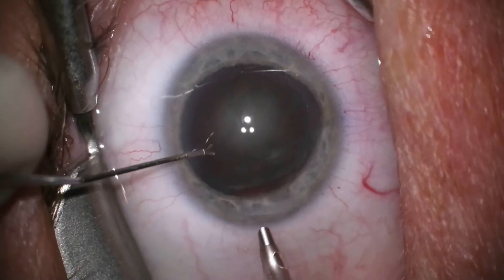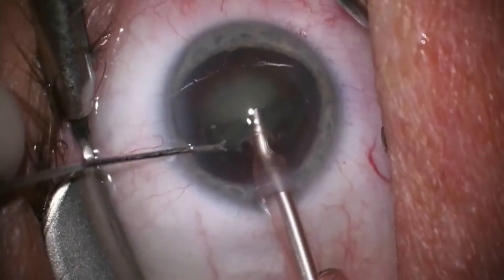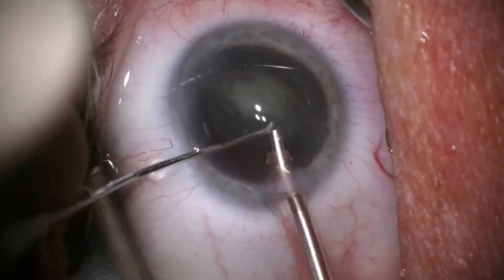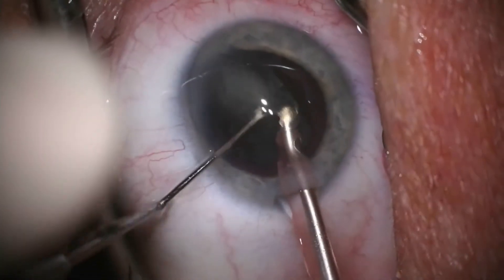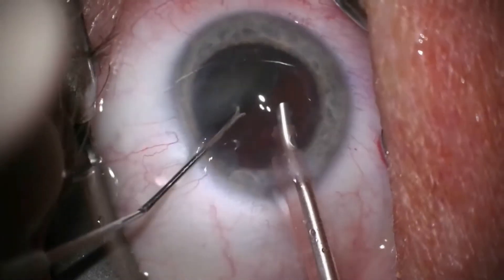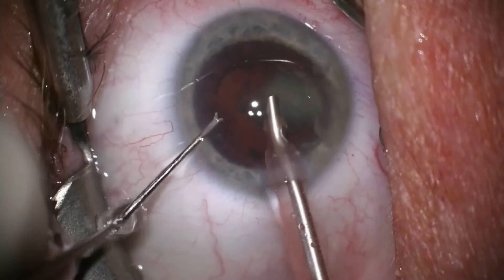Now I am inserting the phacoemulsification handpiece to dissolve and remove the nucleus of the cataract. The handpiece allows fluid to enter the eye while ultrasound emulsifies the cataract so it can be suctioned out through the handpiece. Using a second instrument helps me rotate and guide the nucleus into the phacoemulsification tip.